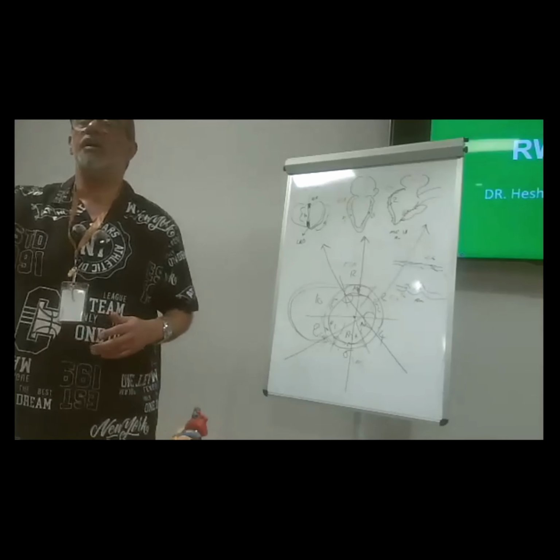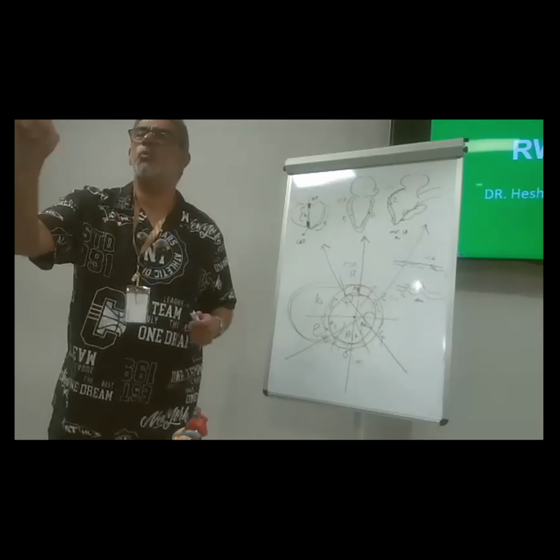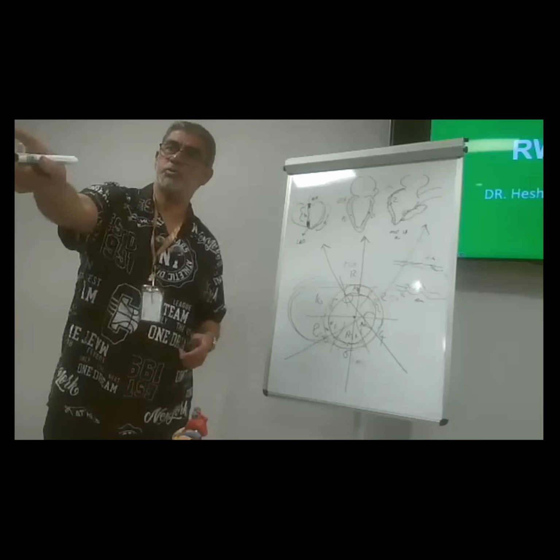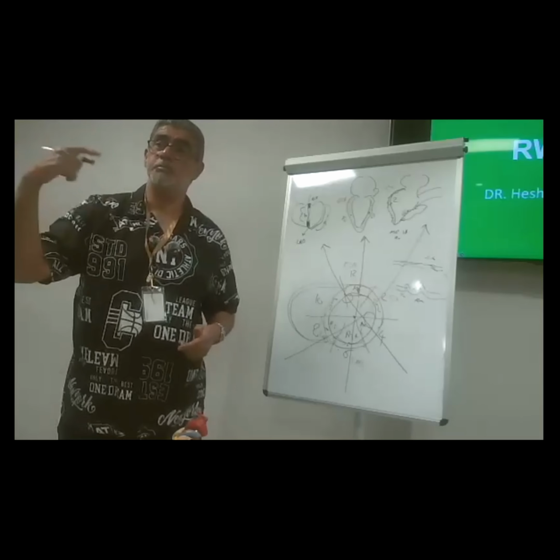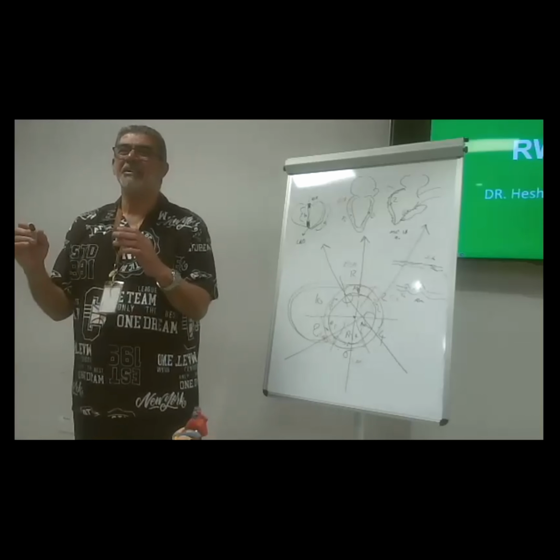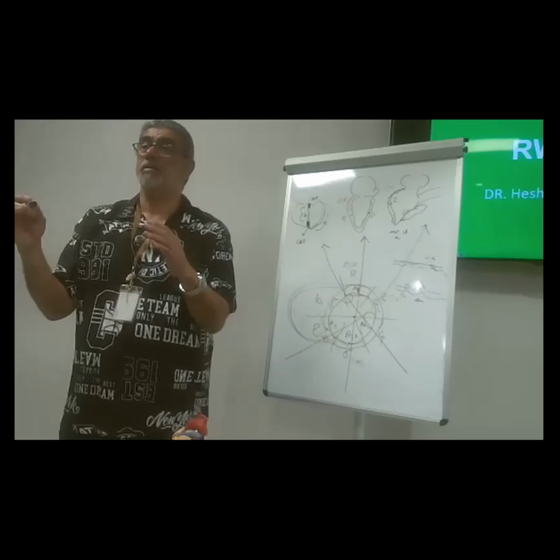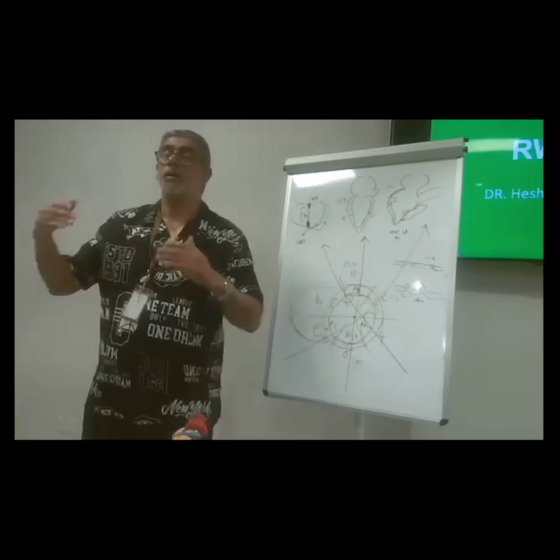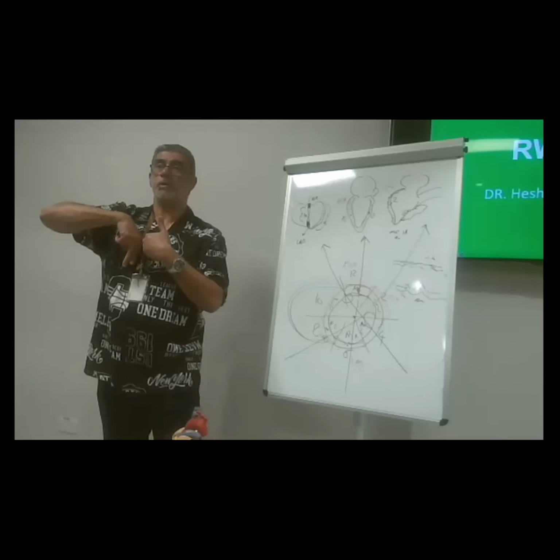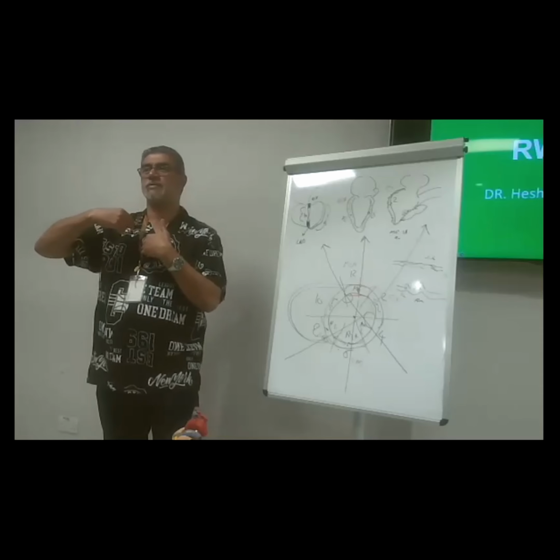If you stay in the OR for one week, you will find this at least once per week. Like the tube, when we go deeper, it prefers to go to the right bronchus because of the anatomical orientation.